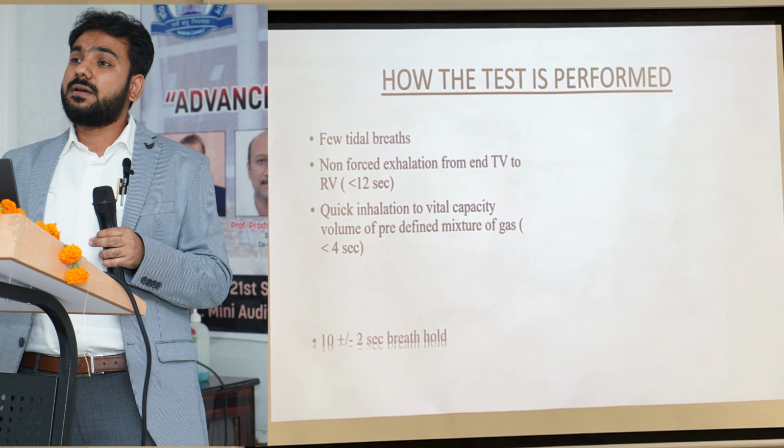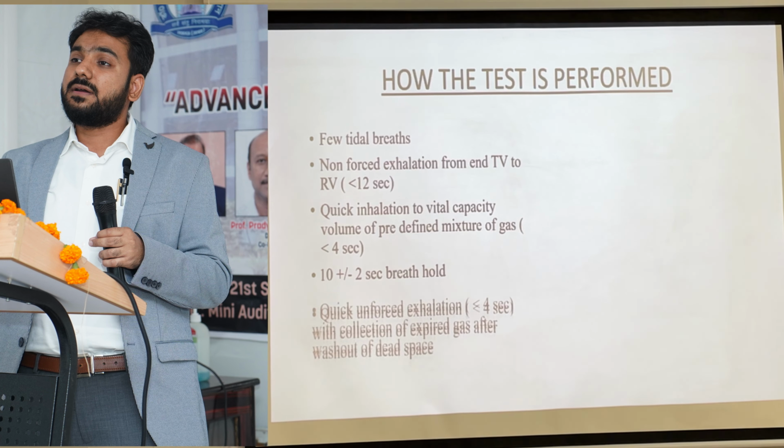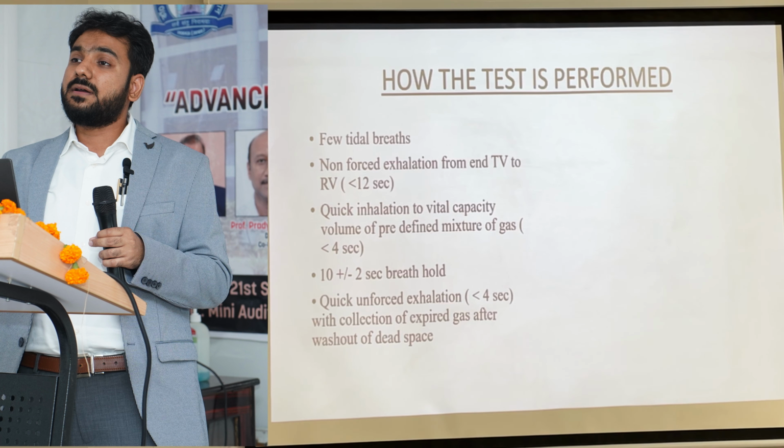And the next step is basically the breath hold. At this vital capacity, we will tell the patient to hold the breath for 8 to 12 seconds so that it reaches equilibrium. The next step is a quick unforced exhalation, which has to be done within 4 seconds, and then this expired air is collected in a gas sampler. The initial part is discarded, which is the dead space, around 600 to 800 ml, and the remaining part is collected, and then there are two gas analyzers, one for CO and one for helium.